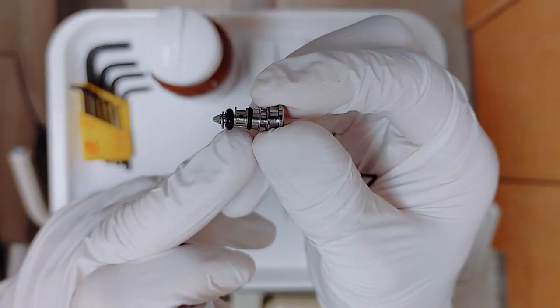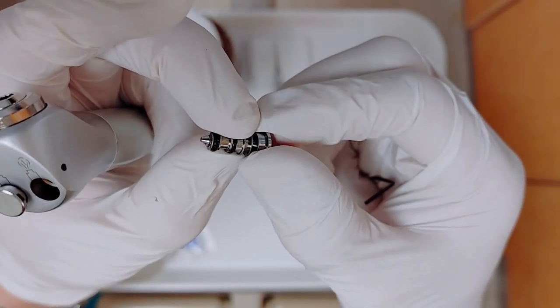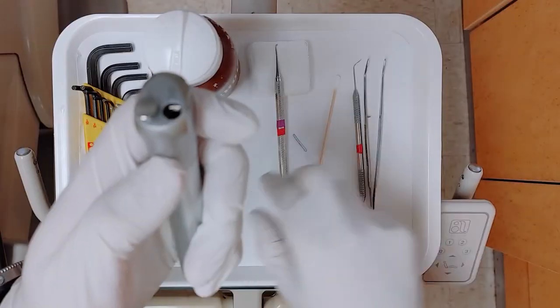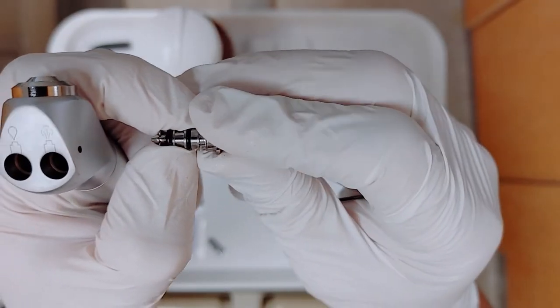And sometimes after a while there's going to be gunk built up inside of these little layers of this little piston that moves up and down. So we can clean all these little bits to get it to be loose and move freely. I can go over here to my water button and pull this one also. Check the piston, make sure that everything's nice and clean.